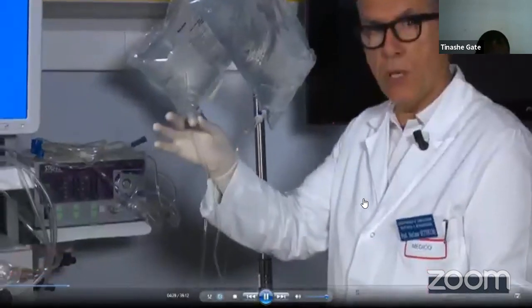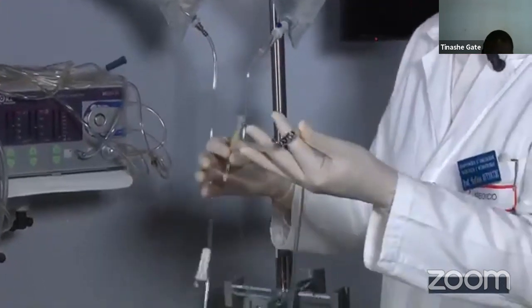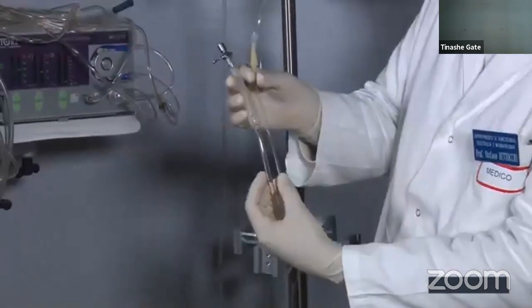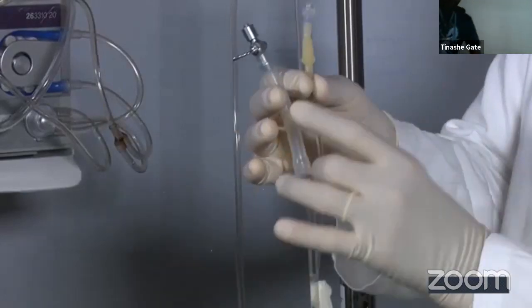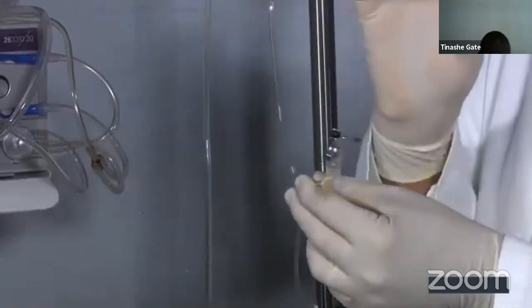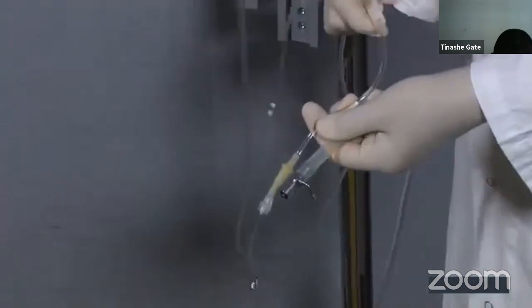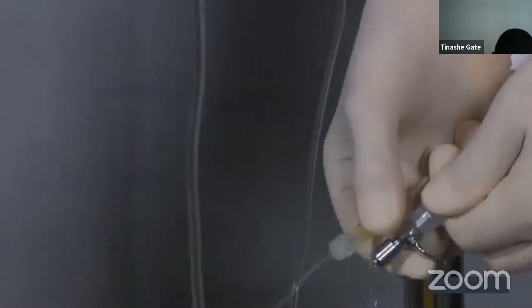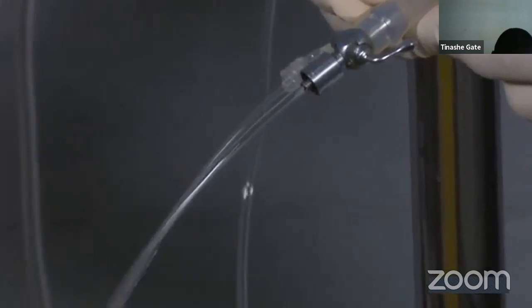This is the simple silicone tube you use for endovenous injection, and this is a typical endoscopic silicone tube. As you can see, the diameter is different. So I will show you what it means: only changing the output tube will change the amount of liquid, the flow coming out. If I open the endovenous system, I have a certain flow. If I open my endoscopic tube, you see, there are two different outputs.